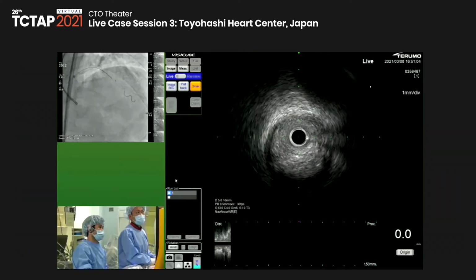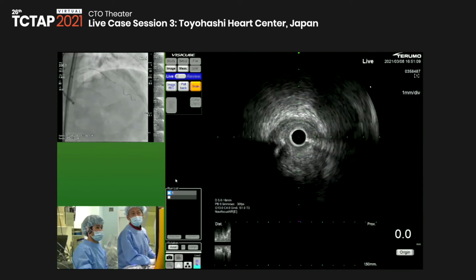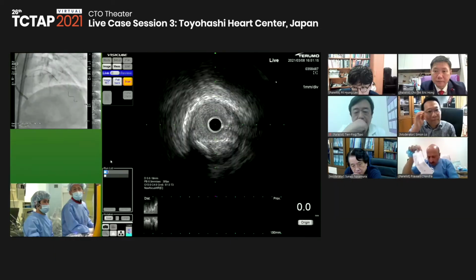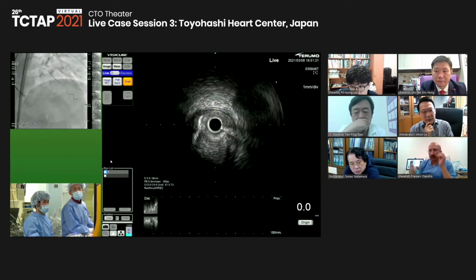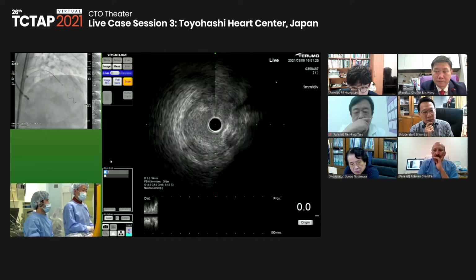But in IVUS, maybe it's not clear. Maybe here we can see some stump, but this is the most distal side of the bifurcation. In this kind of situation, the selection of this small channel is very, very difficult.